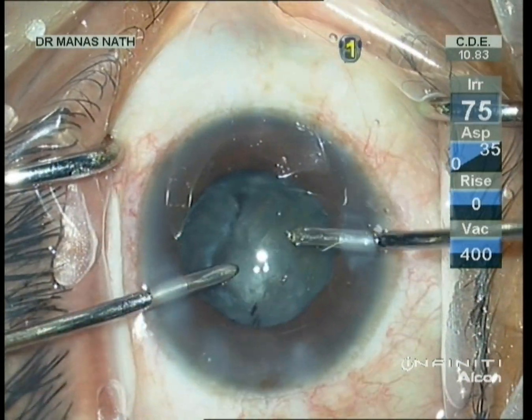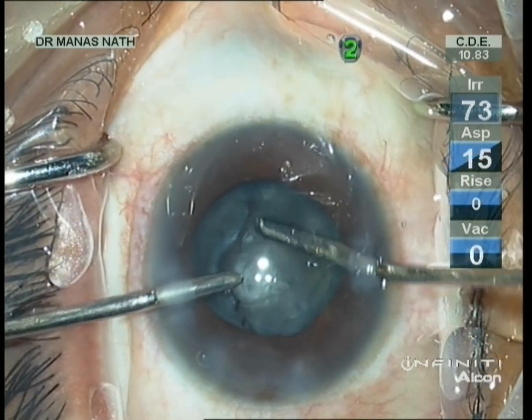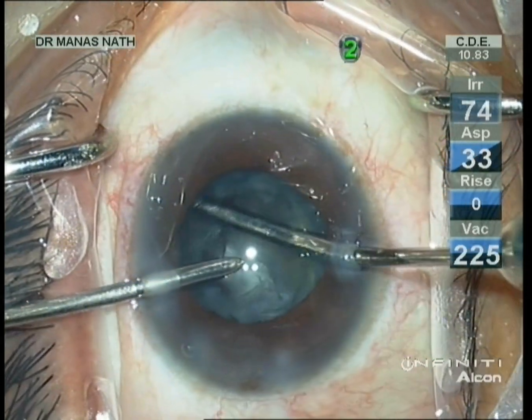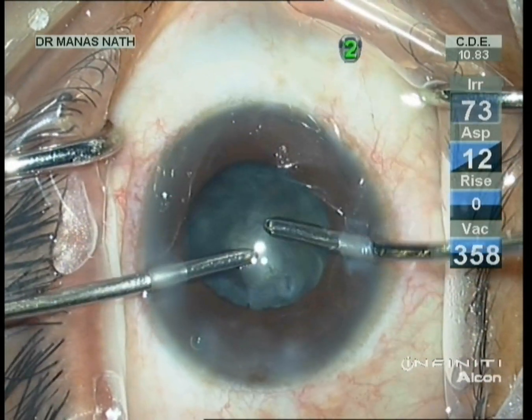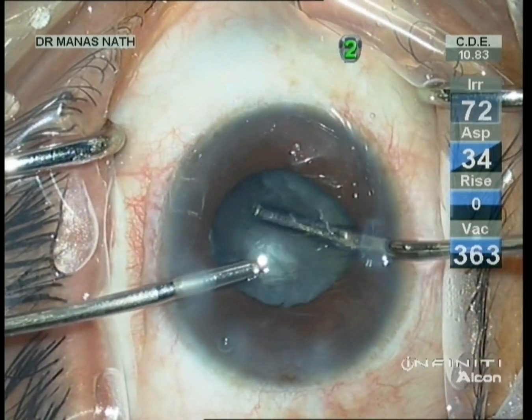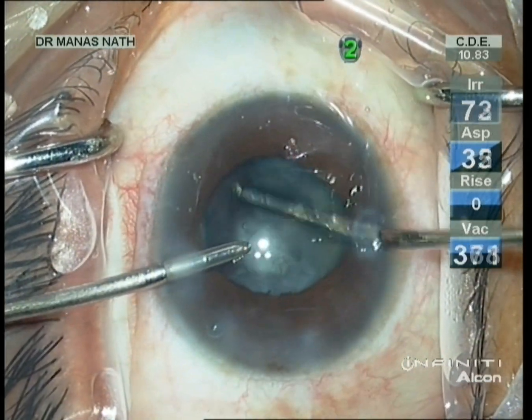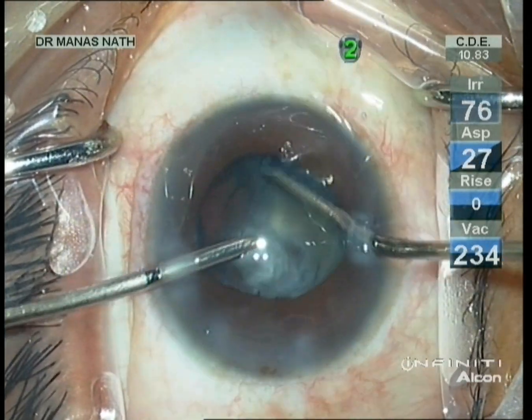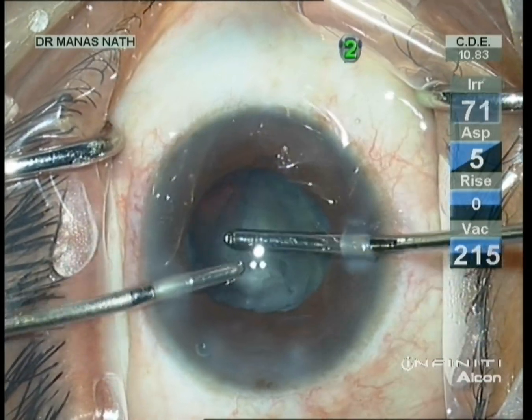Never allow the chamber to collapse — put viscoelastics before taking the instrument out. Now I am doing visco-dissection. Visco-dissection helps not only in forming a protective layer over the posterior capsule, but also in prolapsing the epinucleus from the fornix.